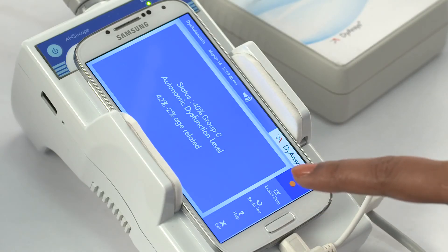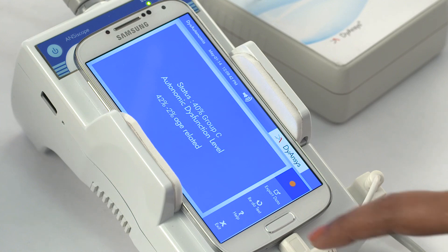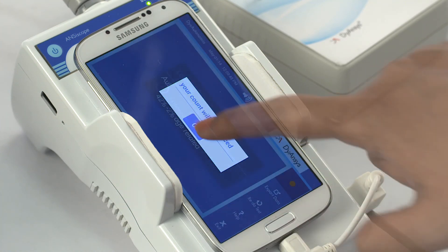Leave the patient in the room and return at the end of the test. Select Export Data to save the results in the patient record, or select Redo Test to repeat the measurement if necessary. Select Exit to leave the AD screen.